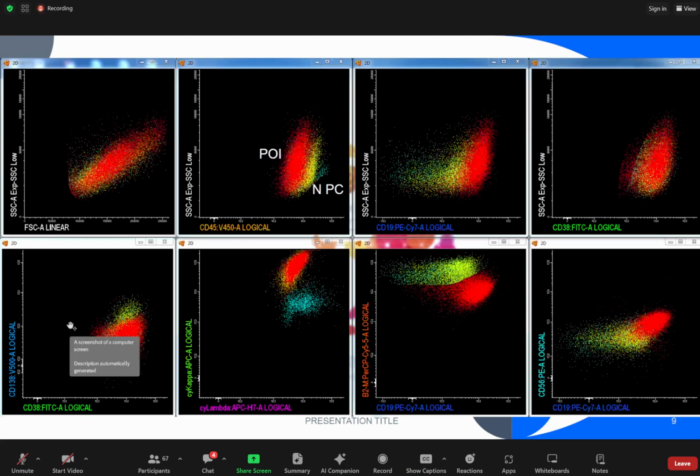I'm not going to comment regarding the CD138 because we have some issue with our CD138 recently in this current batch. A few cases of plasma cells have negative CD138, whereas when we check back in Refine, all these plasma cells are CD138 positive. So I'm not going to comment regarding the CD138.